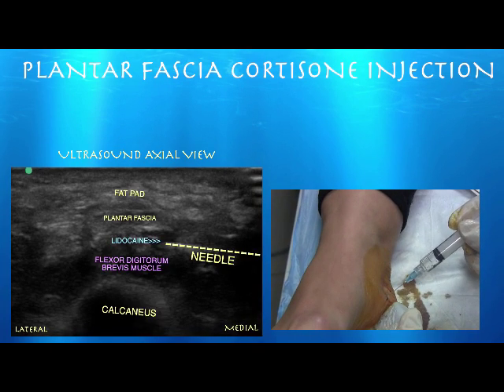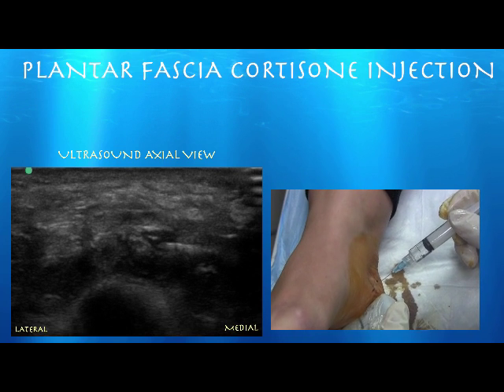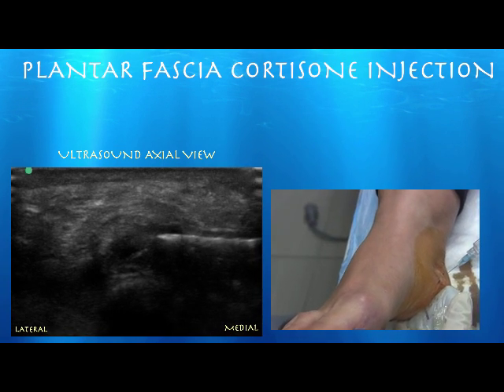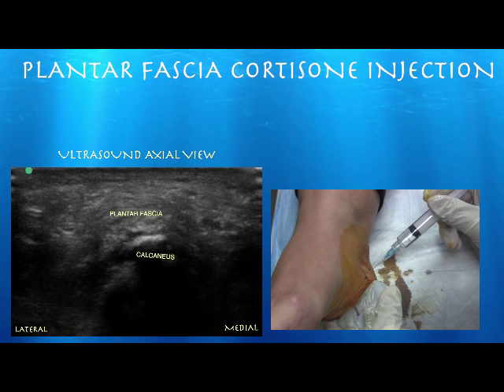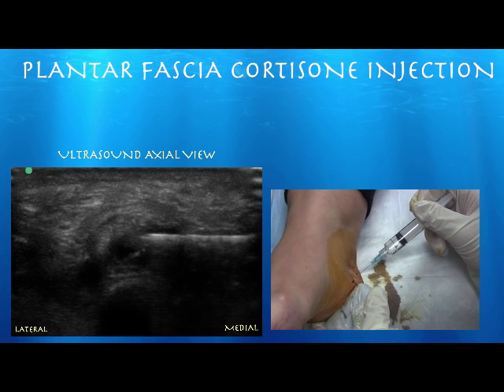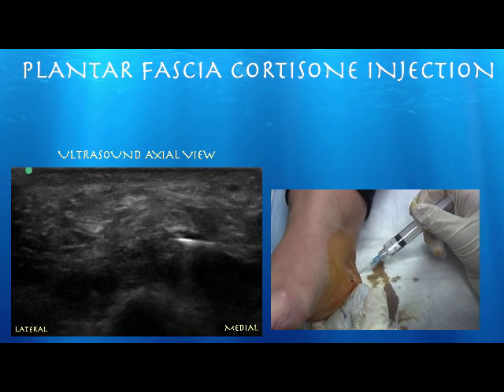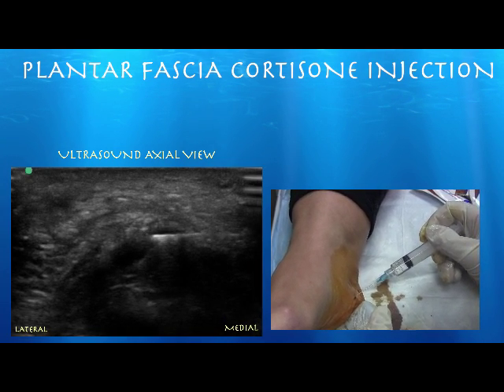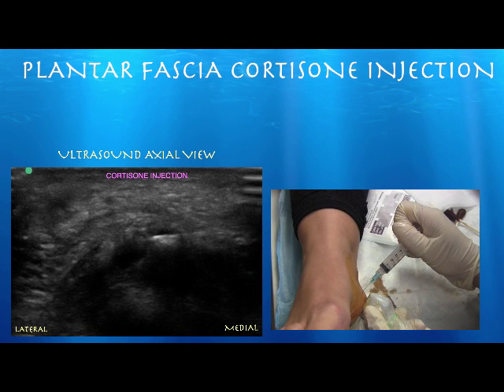Here's our needle going underneath the plantar fascia, between that and the flexor digitorum brevis muscle and calcaneus. The advantage of this technique is that you can see the needle on long axis; however, you can't do any fenestration of the plantar fascia because you're going against the fibers. Here we are injecting cortisone — you can just see a little wash come out of the needle underneath the plantar fascia.